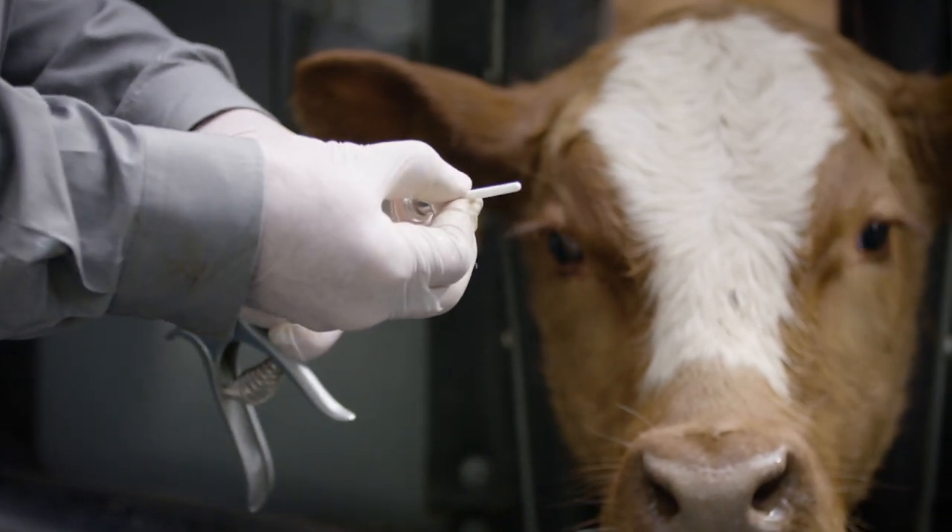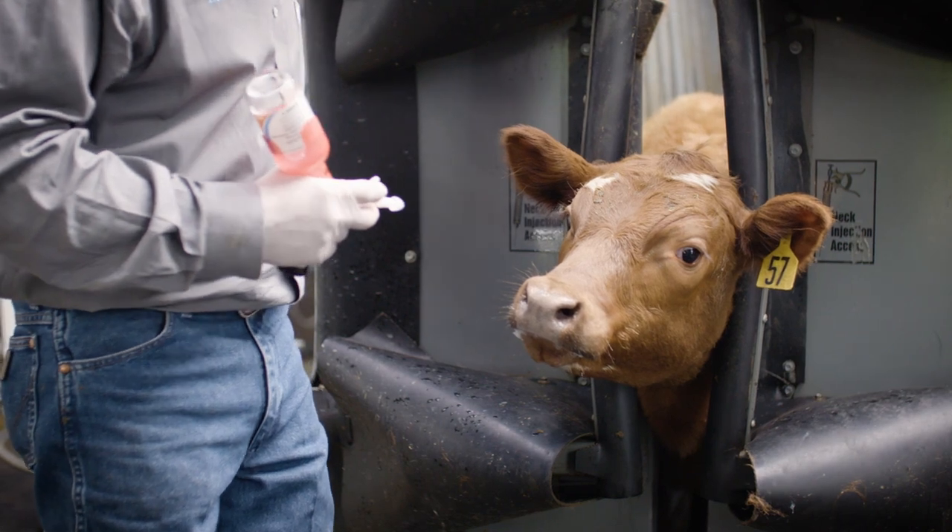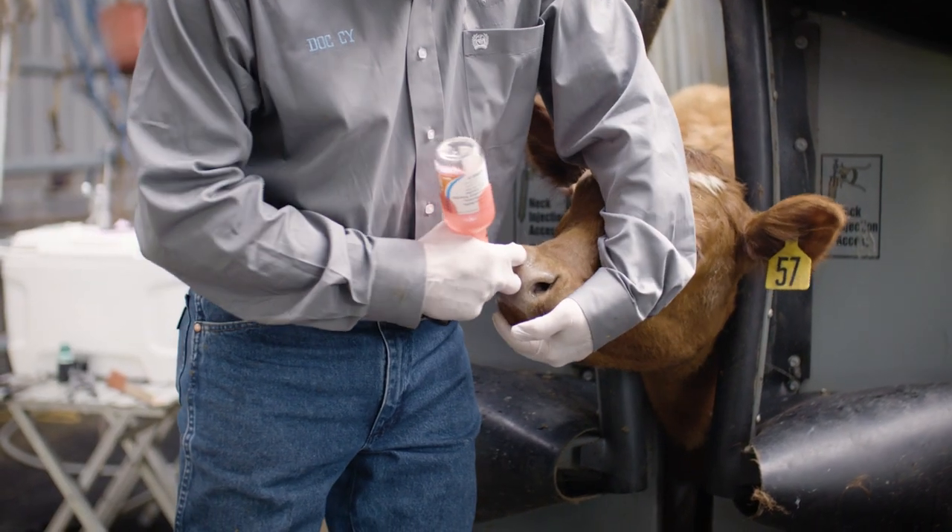Make sure to grasp the cannula only by the collar when removing. On the pump-it device, use a clean paper towel to wipe the tip clean between calves.